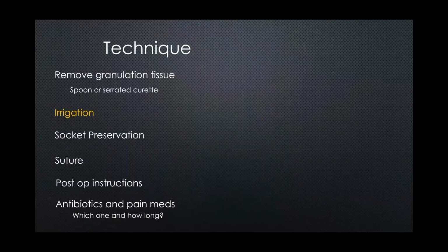Irrigate, irrigate, irrigate, and then irrigate again. This is going to save you a lot of problems with postoperative infections. Very important. Socket preservation, we'll talk about that in a few minutes. Suturing, that's another lecture we can do in the future.